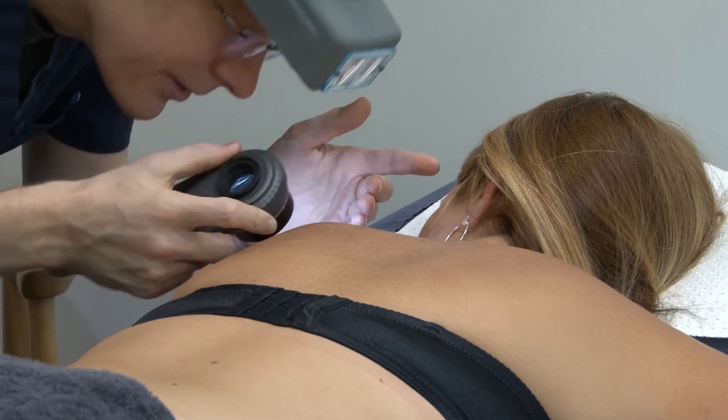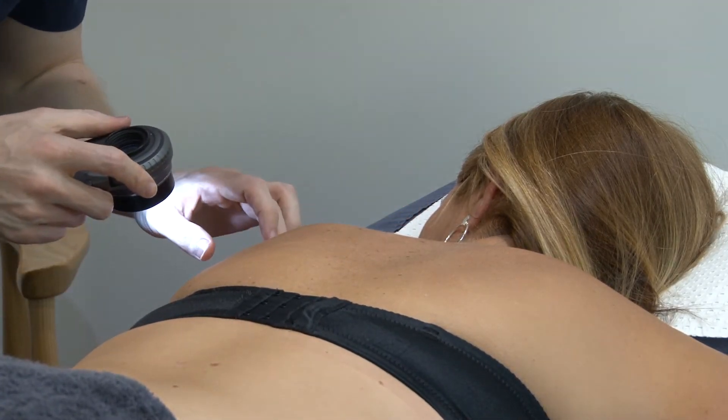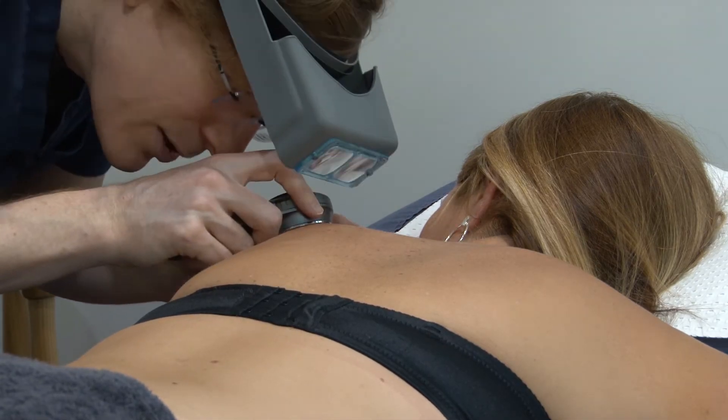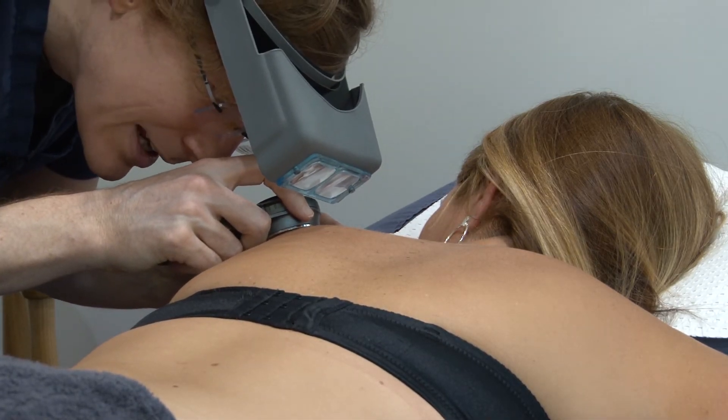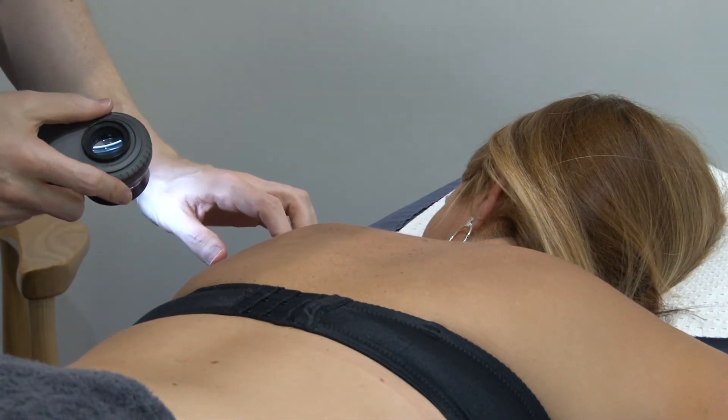You need to then ask the patient if they've got anything that you haven't looked at that they're worried about. If the answer is no, then you can be satisfied that you've done your best as a doctor to find their possible skin cancers. And then you take some good notes, perhaps take some pictures, perhaps mention some things for the patient to keep an eye on. Give them good education about how to detect their own skin cancers in the future, and let them know that if anything's changing, come back and get a check.